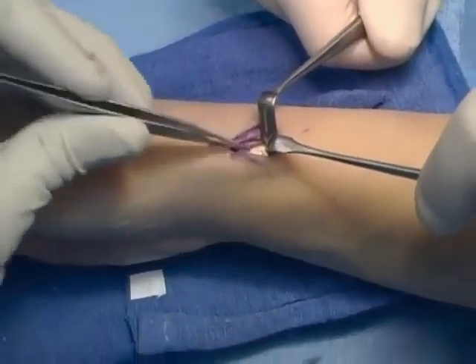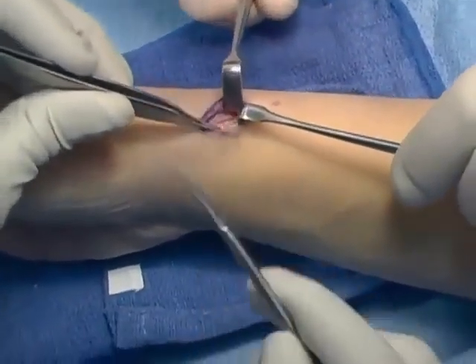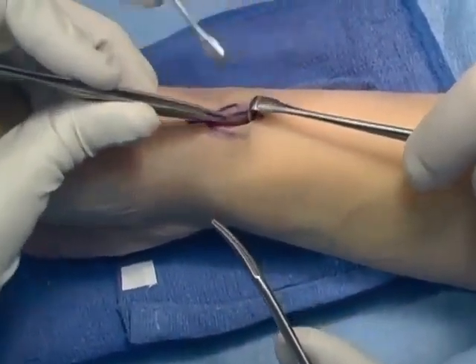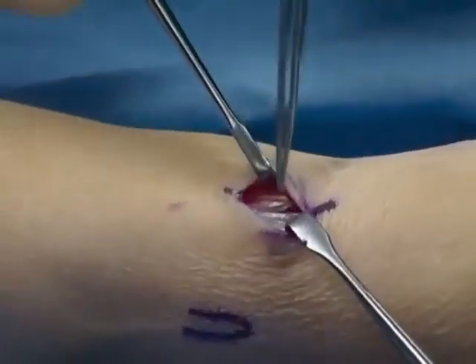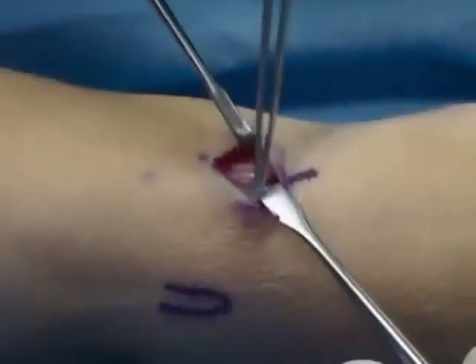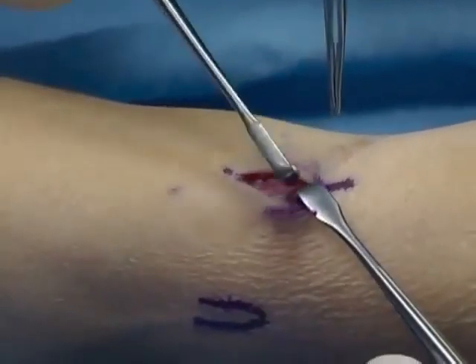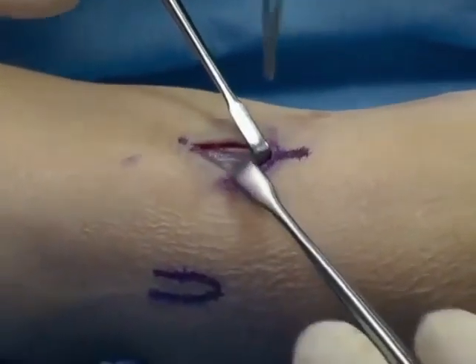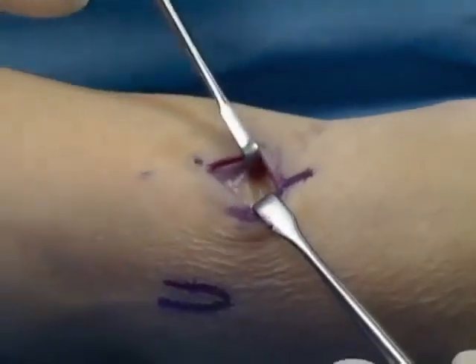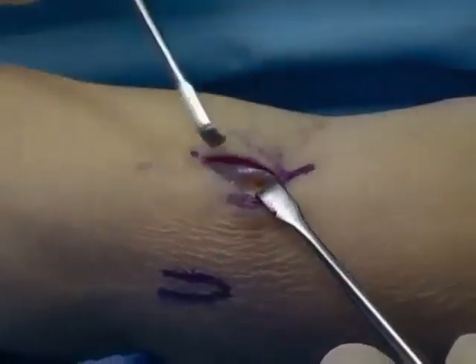Here the radial styloid is being exposed, showing the branches of the superficial sensory branch which are retracted, exposing the styloid for application of the radial styloid pins.